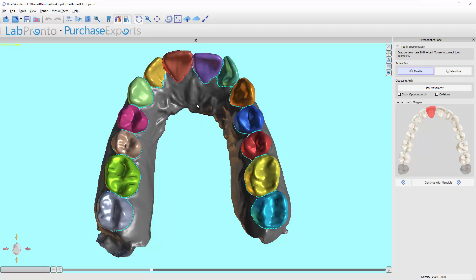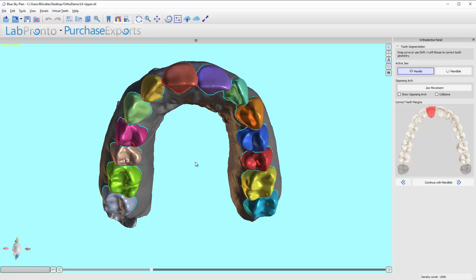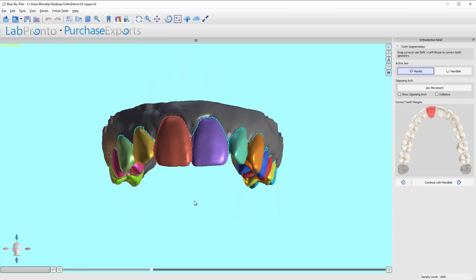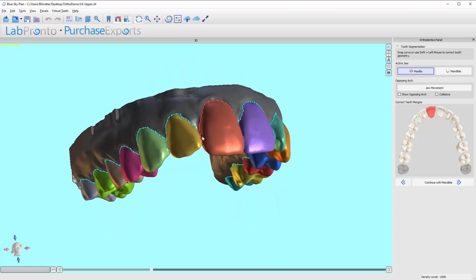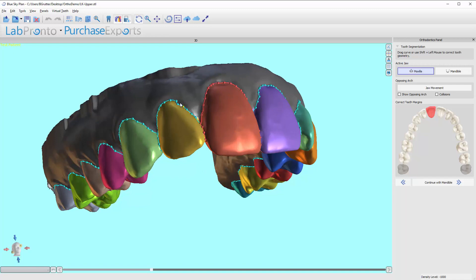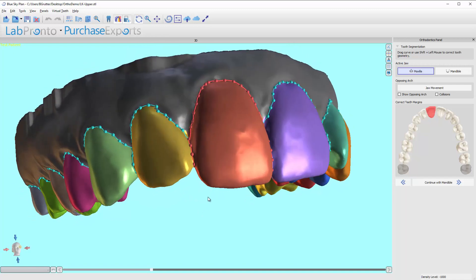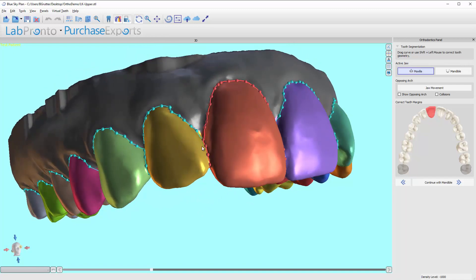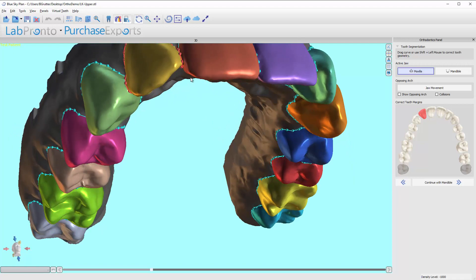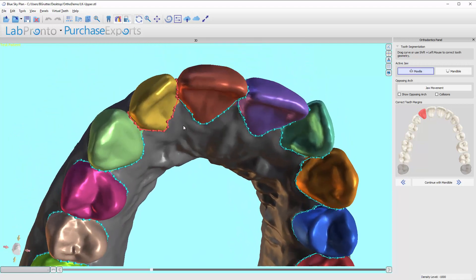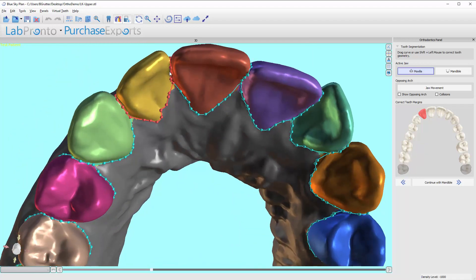We are now in the margin segmentation or tooth segmentation part of the module. If you've used the software before, we had some issues with the embrasure areas and had two separate lines. Notice that now this red line is continuous with this one — these nodes are actually attached and the lines, interproximately, are merged. That makes it very nice for teeth that are touching because now the software just slices between them.